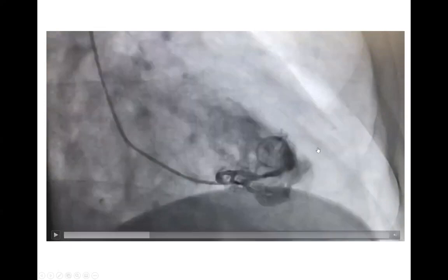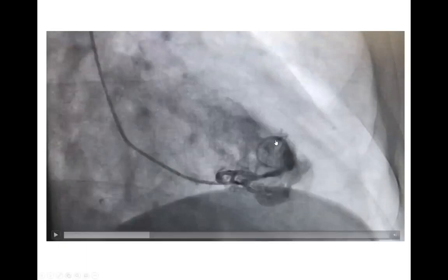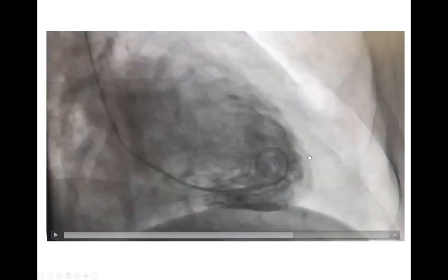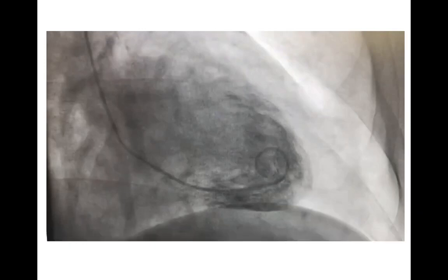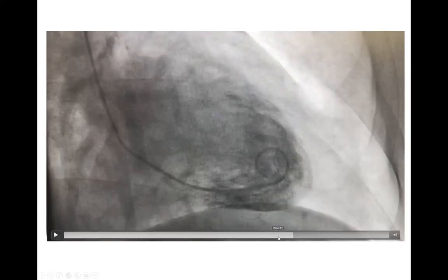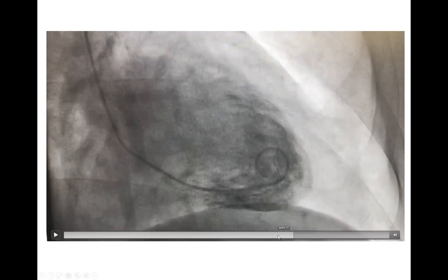Aneurysm means you have a bulging pocket both in systole and diastole. It bulges furthermore in systole, but it's bulging throughout systole and diastole. This one is not bulging in diastole — it only bulges when the remaining wall contracts and pushes it out. So it only bulges in systole. This is what we call dyskinesis. It's mild dyskinesis in this case, not aneurysm.